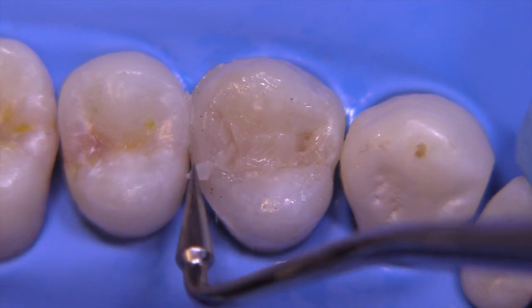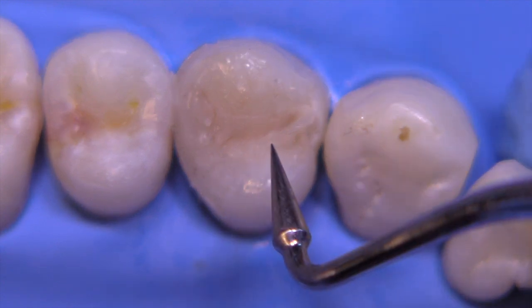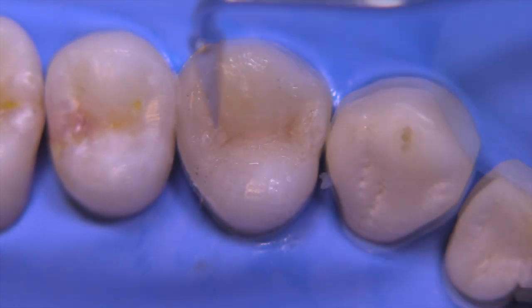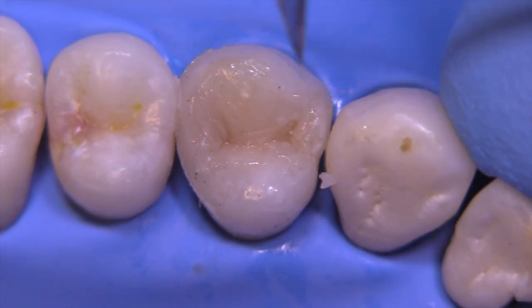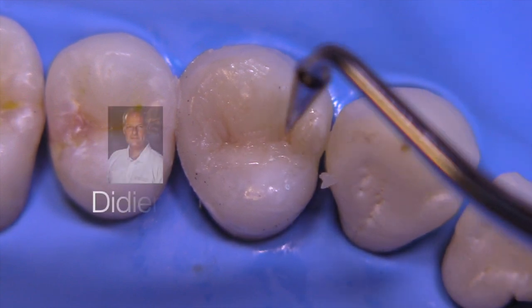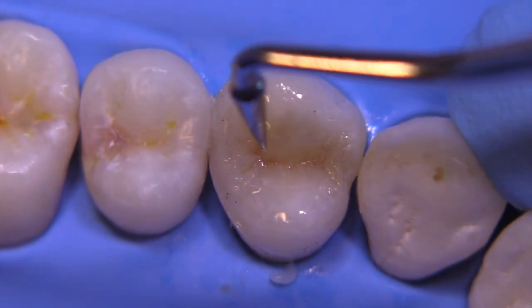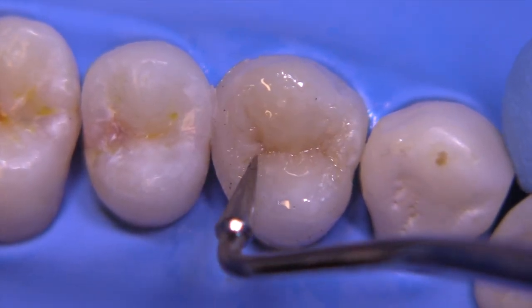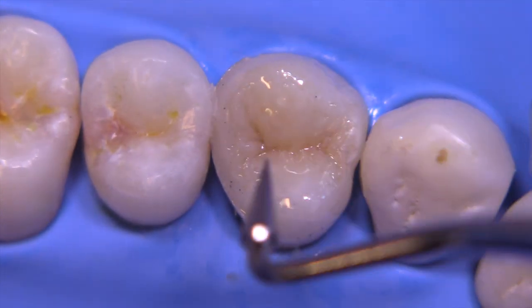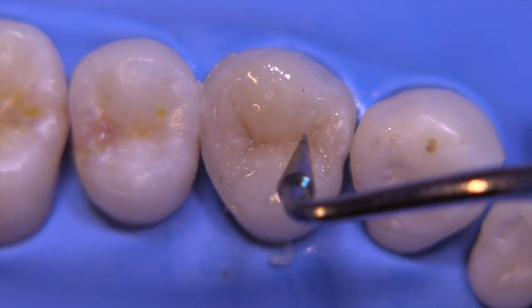I want to leave a little bit of room at the end for a translucent enamel shade. The Compo Sculpt instruments are just fantastic — they were originally developed by Didier Dietschi, a phenomenal composite-placing restorative dentist from Switzerland. Now you can see that I'm developing some micro anatomy, these little nuances that we sometimes see in teeth, and it's quite easy to do with this instrument.